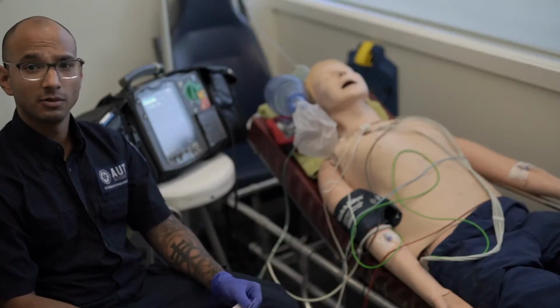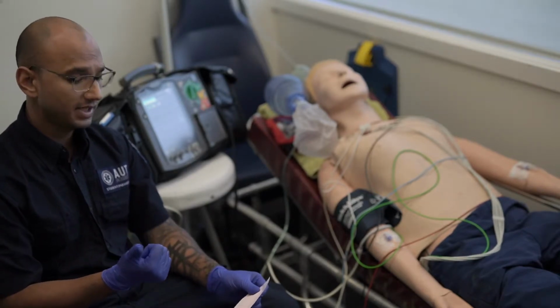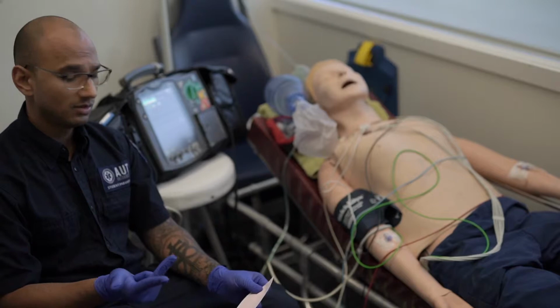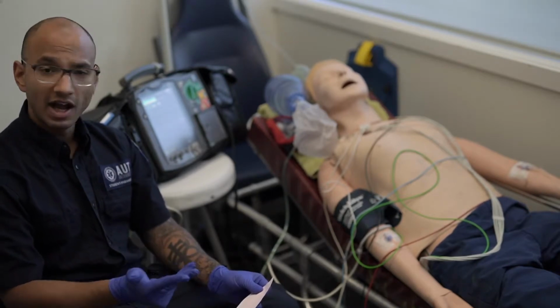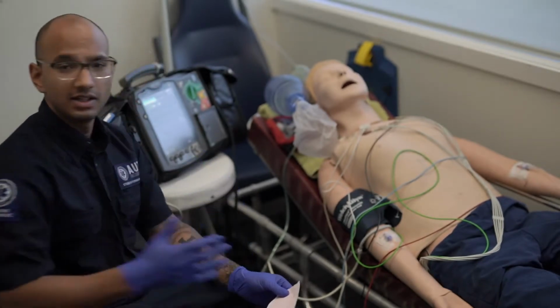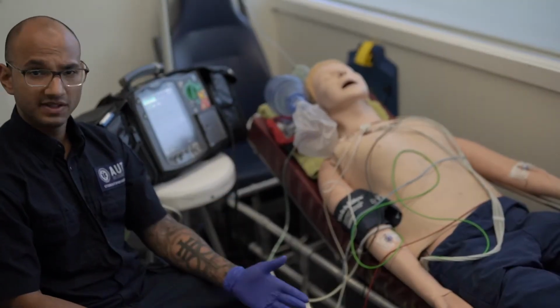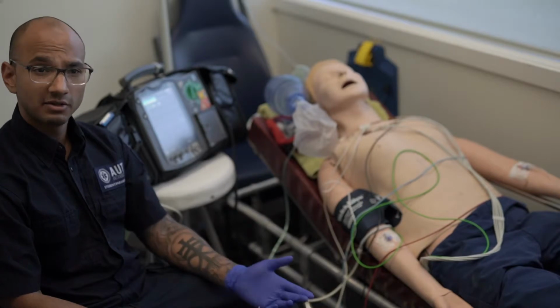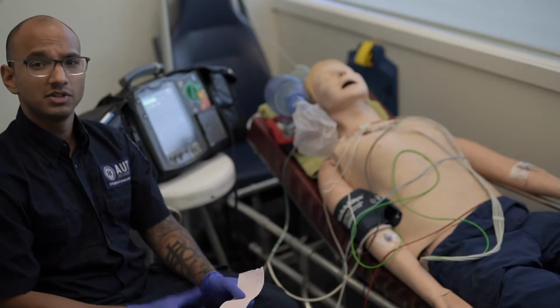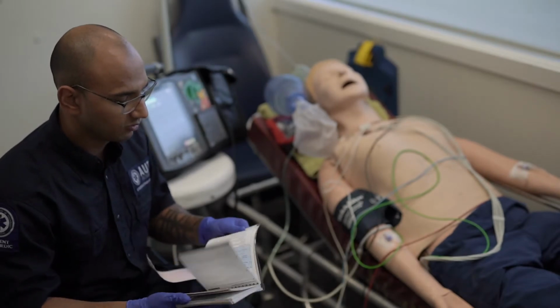Now, continuing on for our confirmation of VT, we have established that yes, he's got a heart rate greater than 150, our QRS is greater than 0.12, our rhythm appears to be a wide complex tachycardia, there are signs of fusion and capture beats, and there is no evidence of any new left or right bundle branch blocks. Now, because we have prepared for a resus and are considering cardioversion, we must go through our cardioversion checklist. To go through this, I will now give my pocket CPGs to my offsider, who will read them out to me.